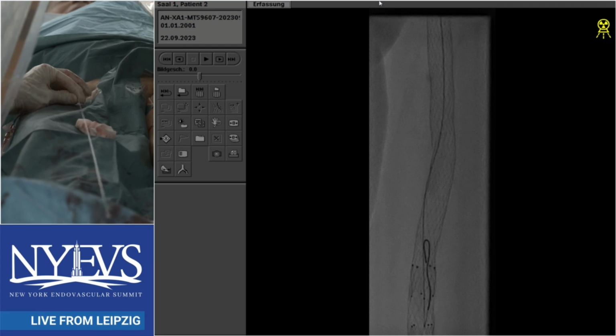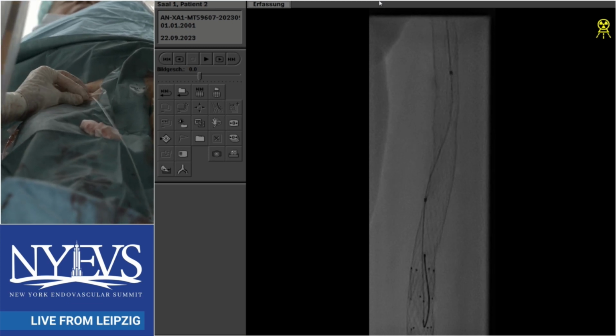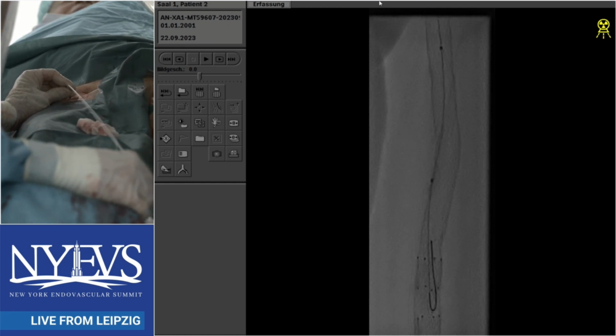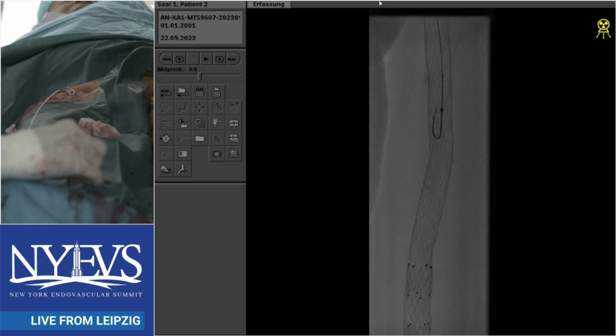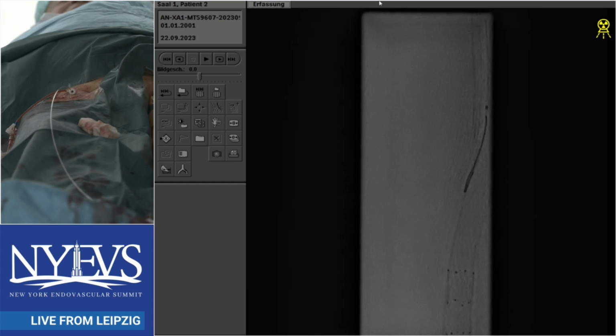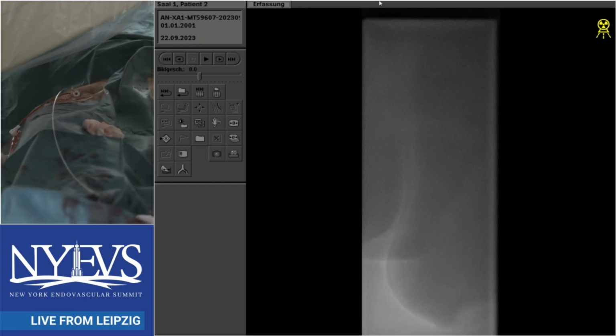Yeah, actually, we always take the... Oh, that's outside. No, that's not good. No matter whether there's a fracture or not, we take this Supera across. No, I have to puncture once again, retrograde. So we never had the problem that we couldn't take the Supera out.